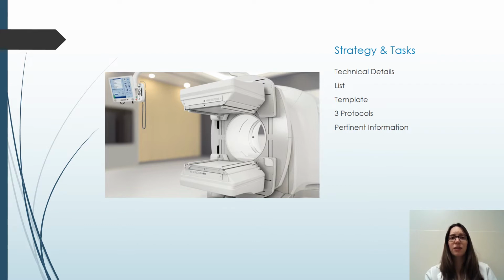I also utilized procedure standards from the Society of Nuclear Medicine and Molecular Imaging, which is also known as the SNMMI. I also included information such as the consulting health physicist, isotope supplier, radioactive material license, organizational structure, and general radiation safety information in the protocol manual.